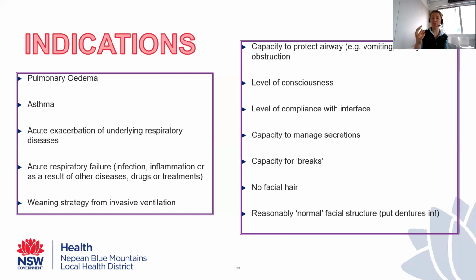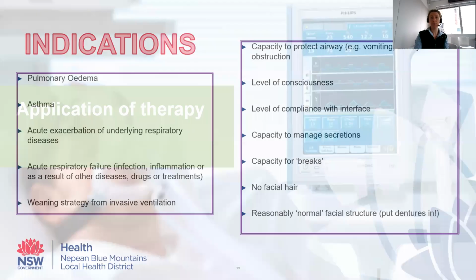And I have seen dentures, with all of the gas flow, be pushed to the back of someone's airway. So if you've got a patient who's had, say, some significant weight loss over the last few months and their dentures are now too big for them.